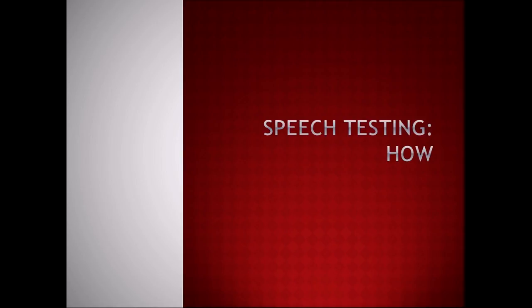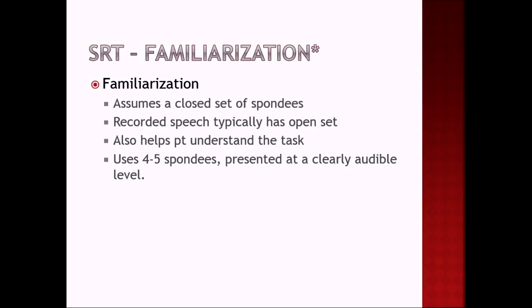Okay, so next we're going to talk about how we do speech testing. First we'll talk about SRT and familiarization. Familiarization has an asterisk here.